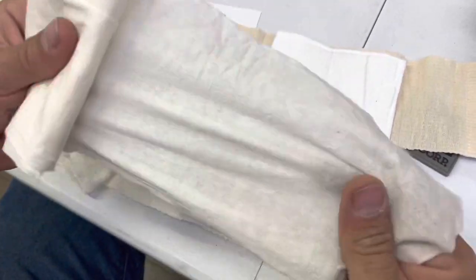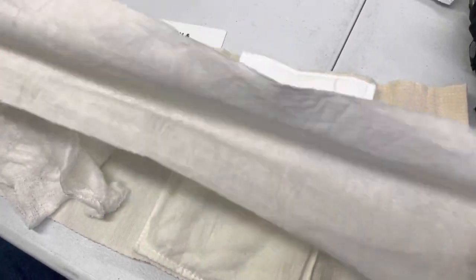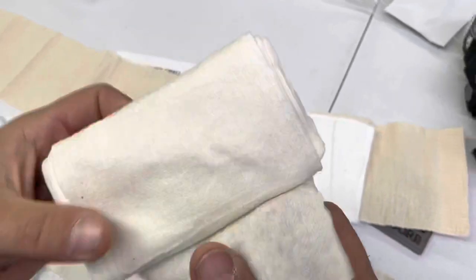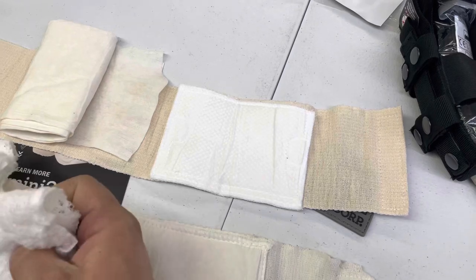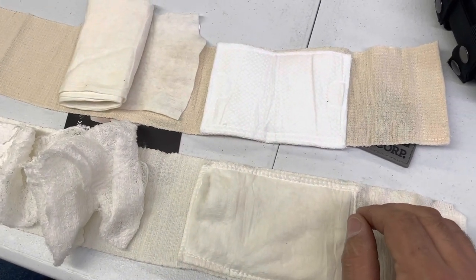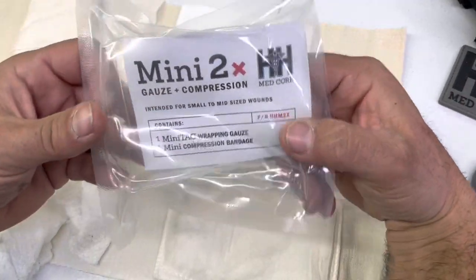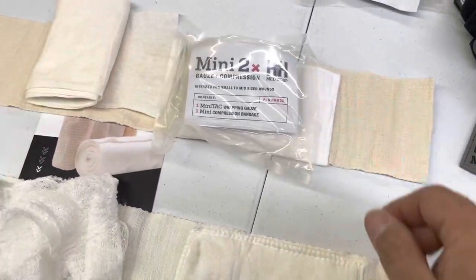Here's your standard compressed gauze versus the linen from H&H. The linen is very nice - to the point where in extreme emergencies you could boil and reuse it. This is a much nicer fabric. Remember you're shoving this into a wound so it doesn't have to be luxurious, but it is very nice compared to the cheesecloth-like compressed gauze. The question is: is the NAR for about $6 all-in a better value than the H&H Mini 2x for $10 retail?